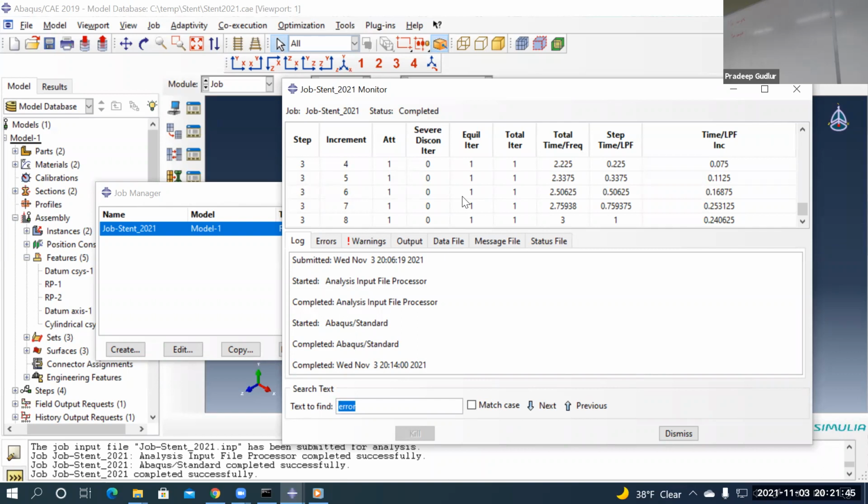But the analysis completed. Yeah, the analysis is made. So you're looking at scale. Okay. This is the time evolution of the problem. The scale factor is not relevant. We need to know this is the time evolution of the problem. It goes from increment 0. So you will see it here. Step 2, step 3, increment all the way. So slow it down to understand it.